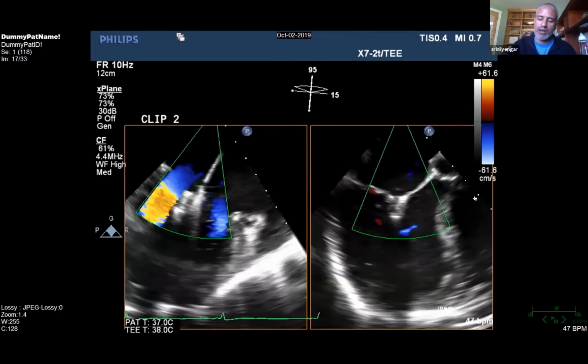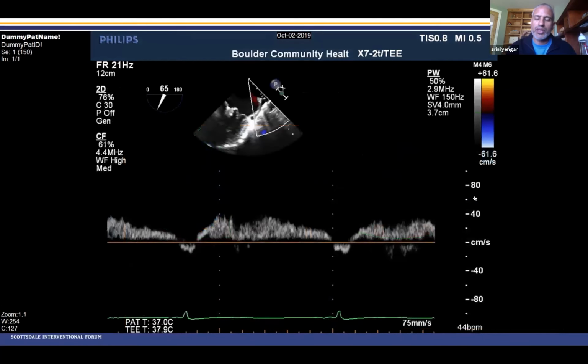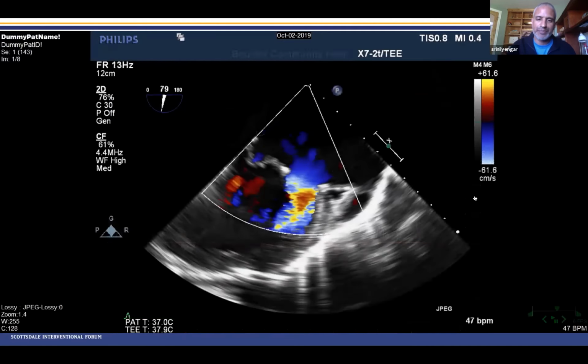Additionally, you can look at the pulmonary vein flow, and here you're seeing a non-reversal actually. You're seeing it go back to its baseline or where it should normally be compared to the initial pulmonary vein reversal that we had seen on the initial TEE. So we had hemodynamic parameters that pushed us to the point to say, though the color was remaining, again, everything else looked pretty good. And we felt at this point in time that no further clip would be necessary with 2 XTs in place.